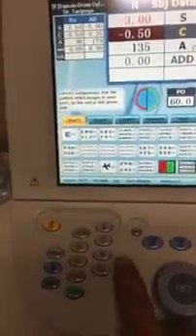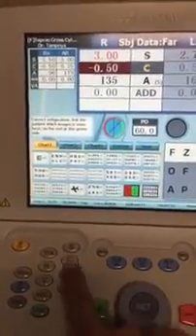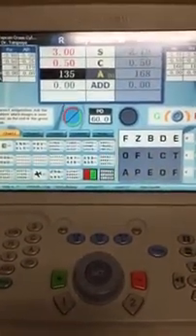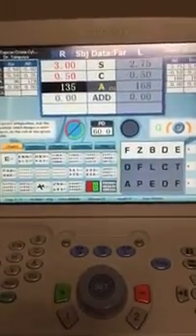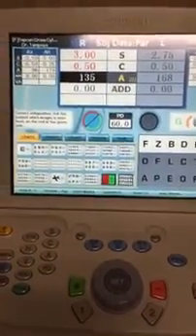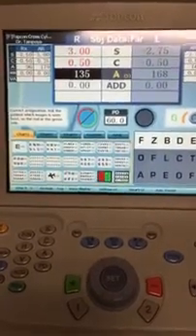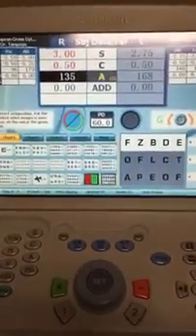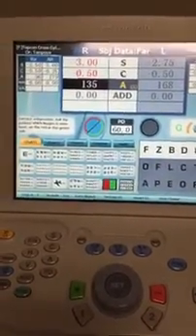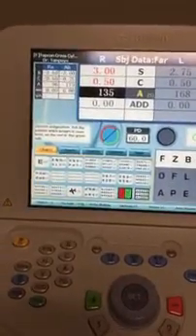If you remember, the axis is where we started at, but I had to go back up to the cylinder to screen for it first. So we're going to go to the axis, and now we're going to say which side is more clear, the upper right or the lower left. So let's just say they tell you the lower left, the green side. Now, since this amount of cylinder is less than 1, I change the amount of degrees by 15 degrees at first, but this time I'm going to go in the green direction.